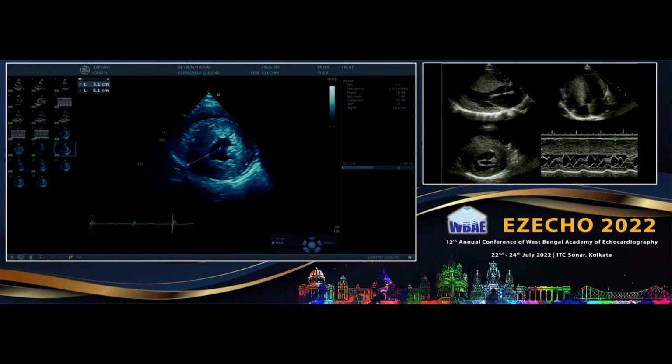So no one has put in the literature how to measure. What they did at the European Society of Cardiology conference was that the very excellent centers of imaging, all those professors, they called them to one booth and gave them paired images of echo and MRIs without telling them whether it is the same patient or a different patient.